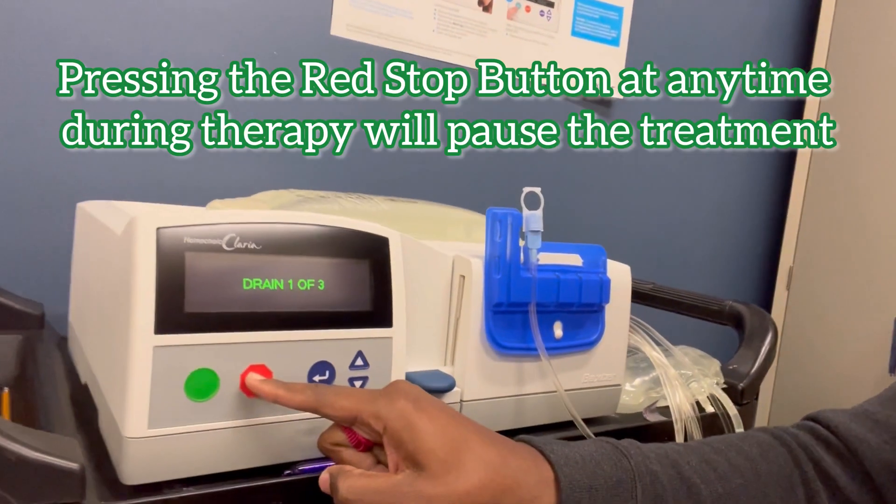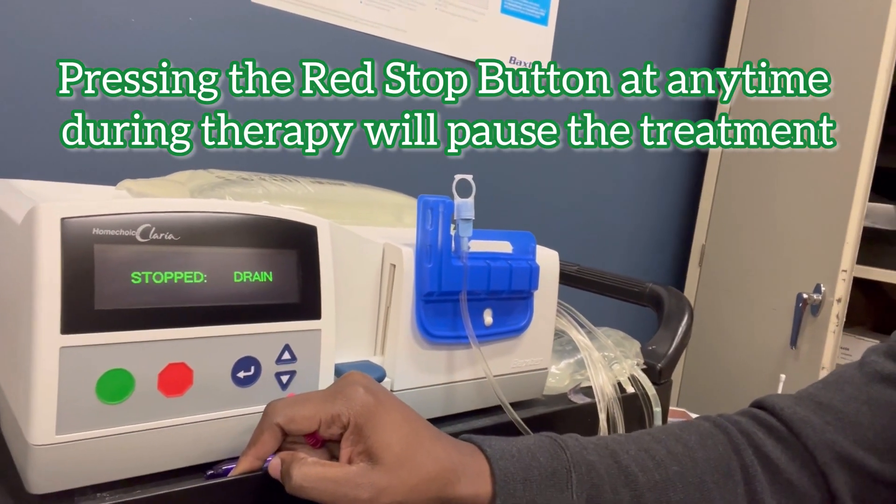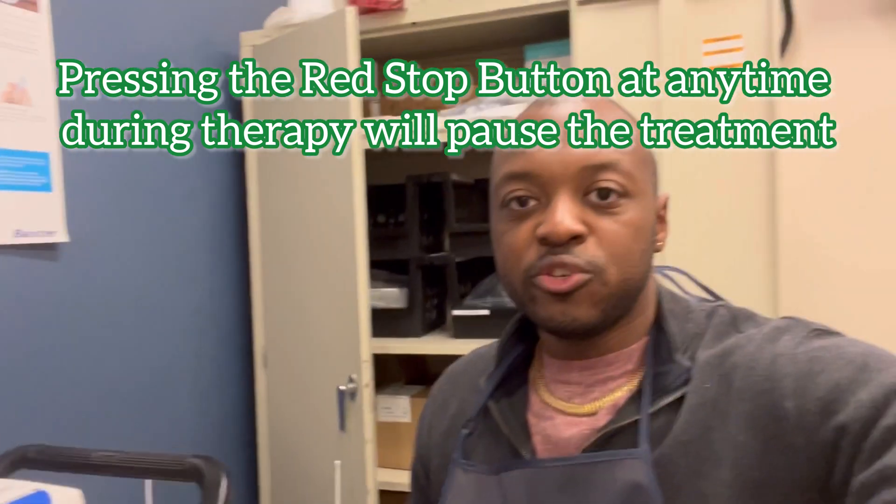I'm not going to pee on myself, so I'm going to press the stop button, which is the red button. Drain stopped. My treatment's stopped — I'm supposed to be draining right now, but I'm not. So I'm going to do an emergency get-off procedure, go to the bathroom, come back and restart the treatment. This is how it's done.